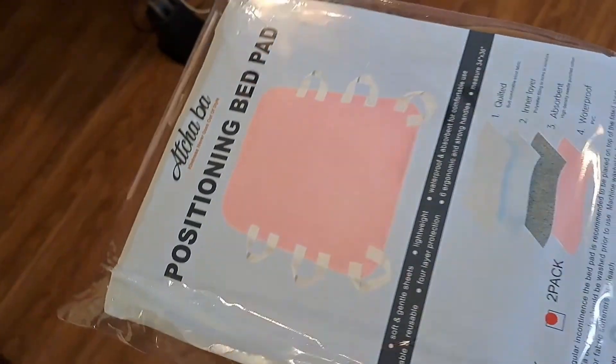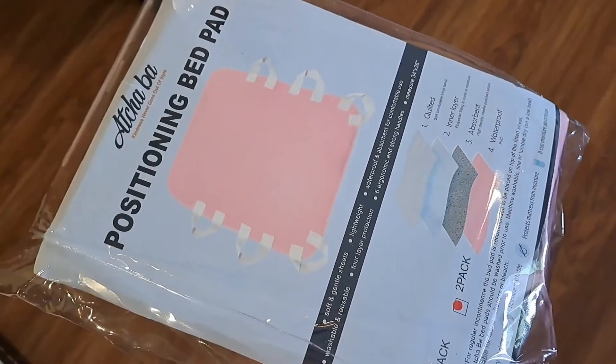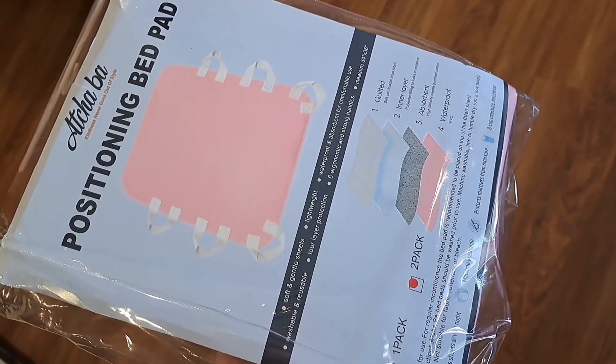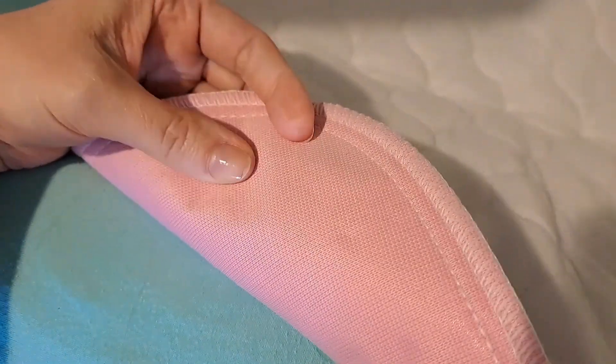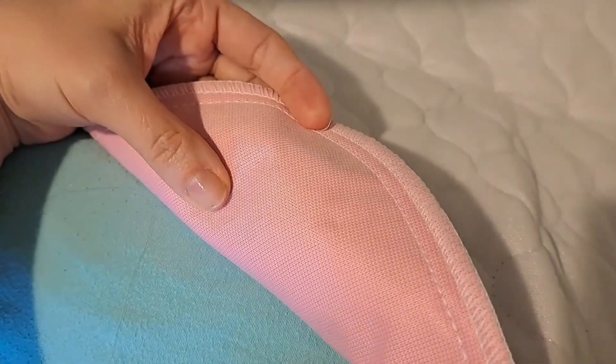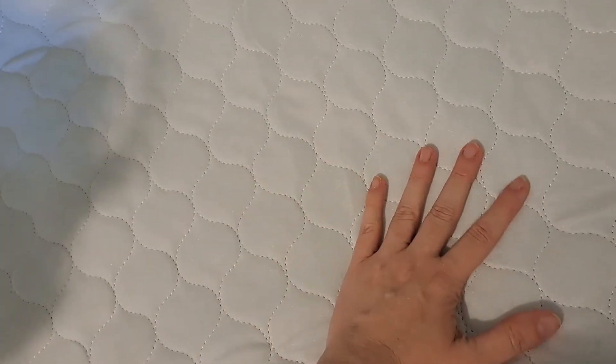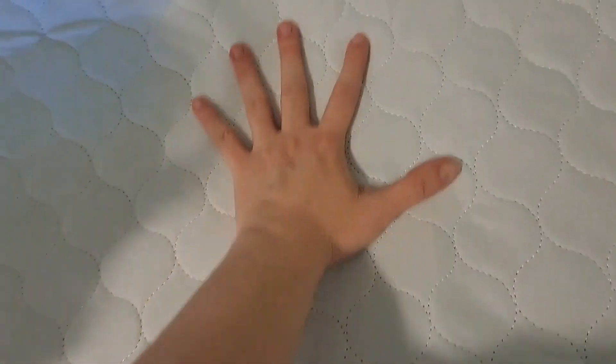At the recommendation of our home health nurse, we bought two of these positioning bed pads. I'm going to show you how it fits on our bed. The pink side goes on the bottom, and that is your waterproof layer. And then this is a nice soft white quilted layer.